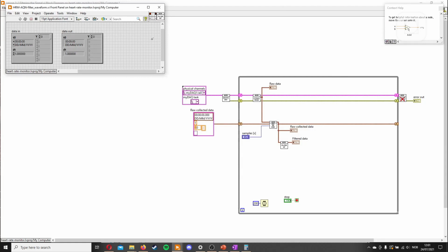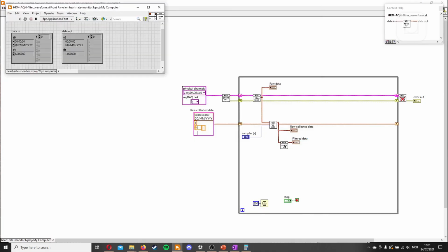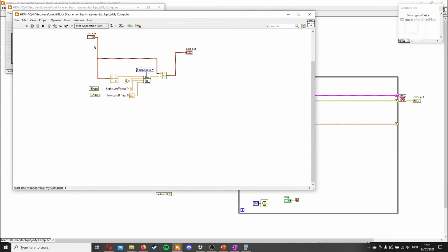But as you saw, there was this little thing at the start. We want to remove this. And to do it, we can just set up a function which can remove part of the signal. So we'll do that here. We'll do that after we have filtered the signal. You just move this here and we'll write here, filter the signal.